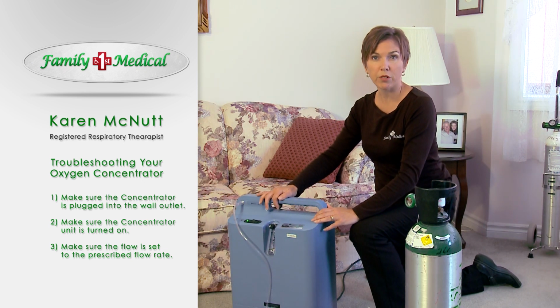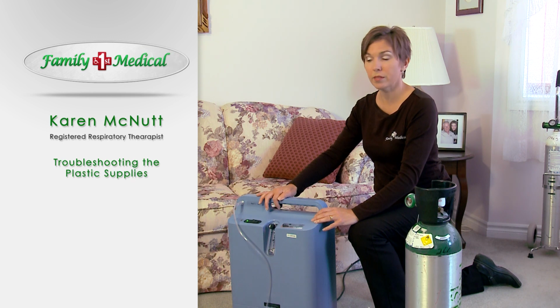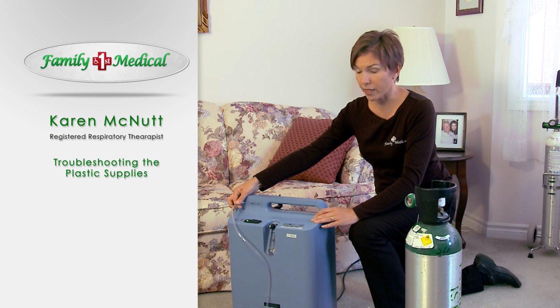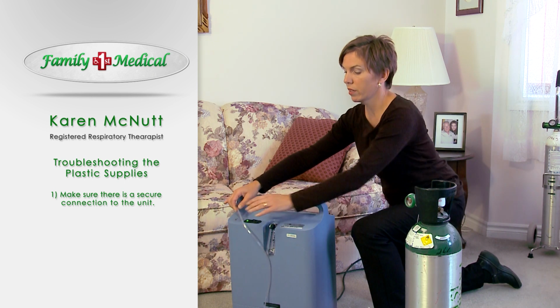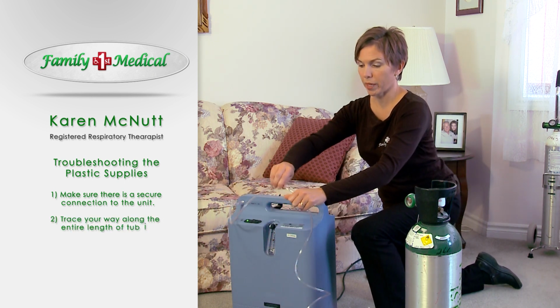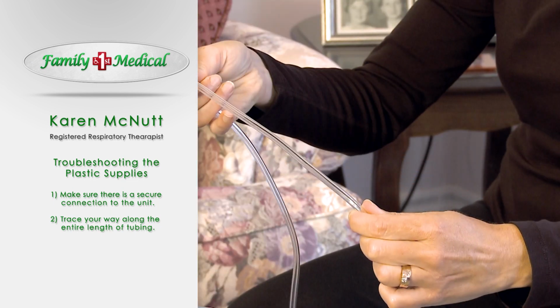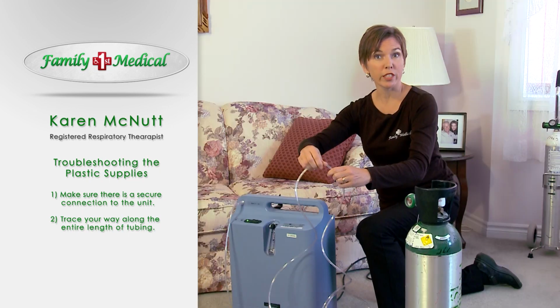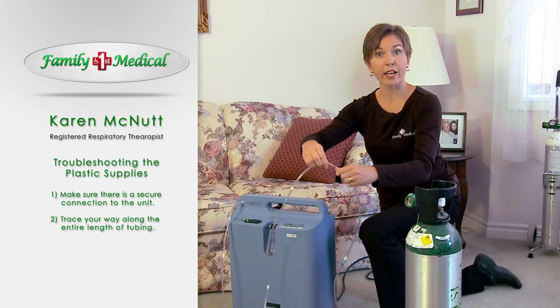Once we've checked the concentrator and determined there's no problems, we then want to start checking the plastic supplies. We're going to start again at the machine and work our way to the patient. First, let's check to make sure that it's connected to the unit. Once we know it's secure, we're going to trace our way along the entire length of tubing. When you're pulling the tubing through your hand, simply look for kinks or cloudy areas in the tubing. Maybe it's caught under a door casing or in your lift chair. And again, we're just going to continue until we come to the connection.